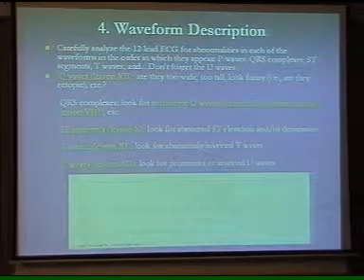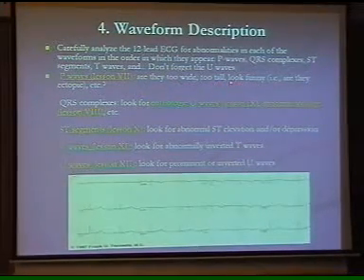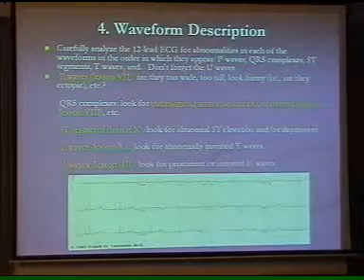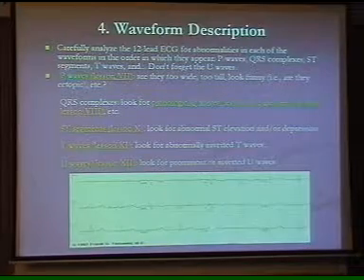Now, the P wave morphology. Do they look too wide? Are they too tall? Do they look funny? The significance of that is that the P wave is the combination, the sequential activation of both atria, right and left.